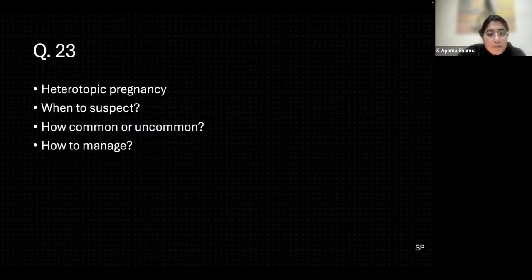So doing 3D in the first trimester will help us diagnose interstitial ones. Just looking at the sac won't make us realize where it is located. But if we take a 3D and run a sweep, we will certainly feel that it is outside the endometrial cavity. Absolutely. And I think this is one of the important uses, where we can really make a diagnosis.